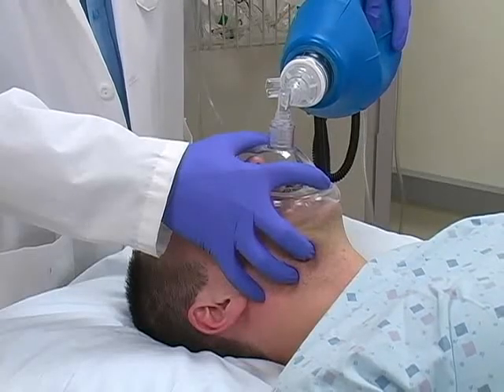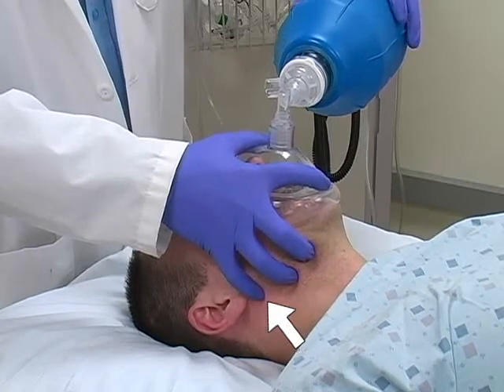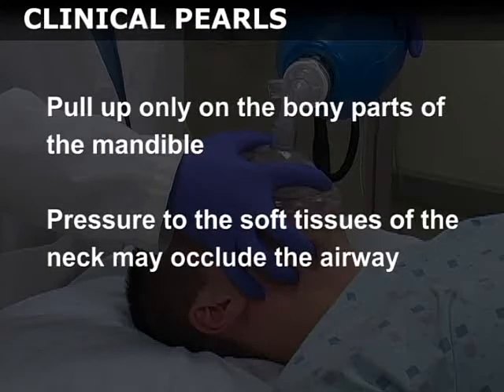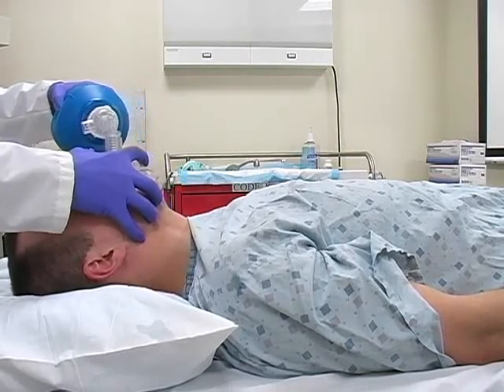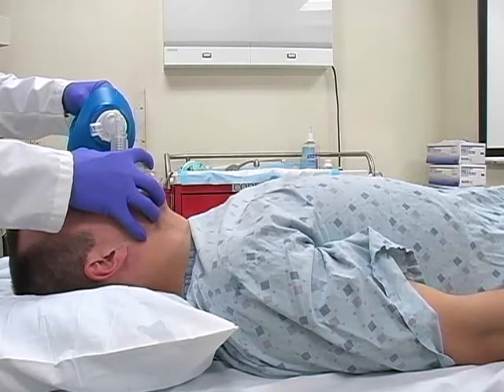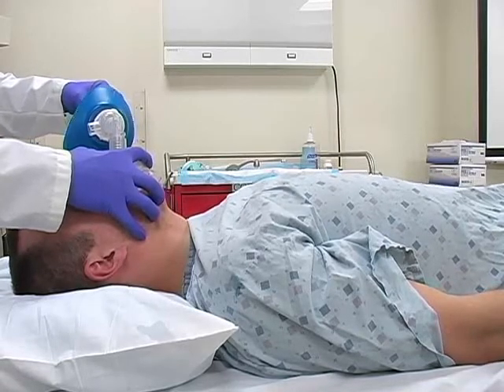If your hands are large enough, your little finger may be placed posterior to the mandible and perform a jaw thrust maneuver to provide further airway opening. Pull up only on the bony parts of the mandible. Pressure to the soft tissues of the neck may occlude the airway. Once a good seal has been achieved, begin to ventilate the patient. In most cases, the ventilatory rate should not exceed 10 to 12 breaths per minute. Use a tidal volume just large enough to cause the chest to rise.